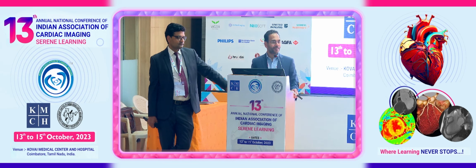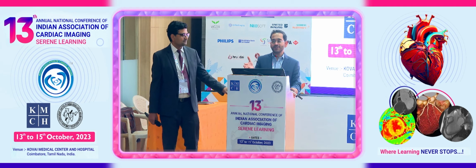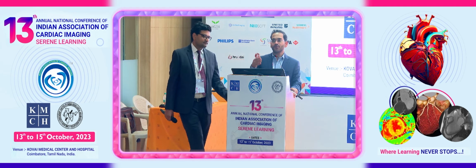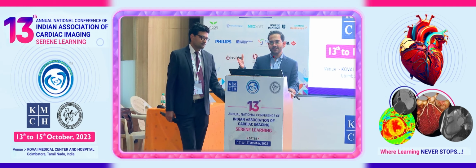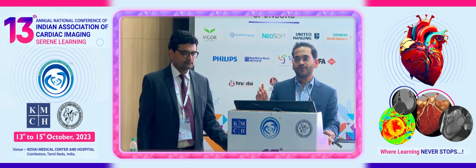Go ahead. Yes, I showed some of that data on my slides. Not only is the presence of a high-risk plaque feature important, but the more high-risk plaque features that are present, the more it is related to the development of acute coronary syndrome down the line.